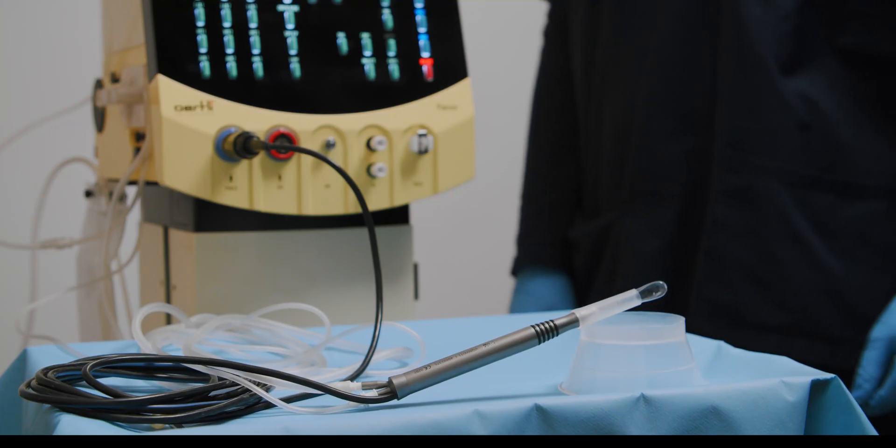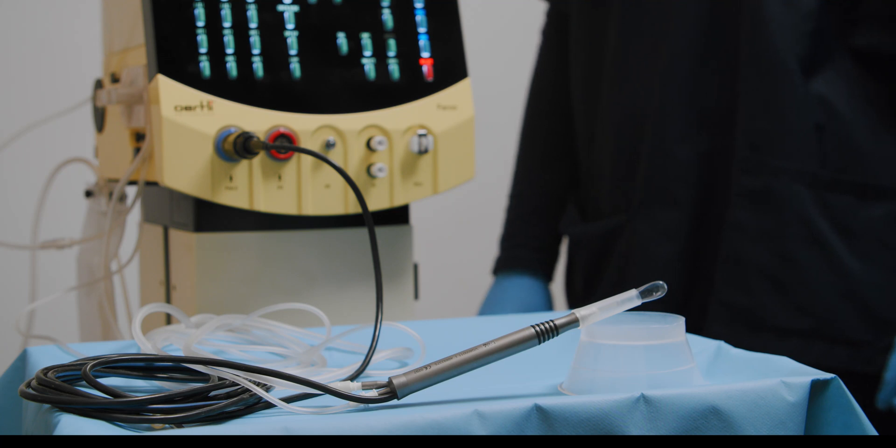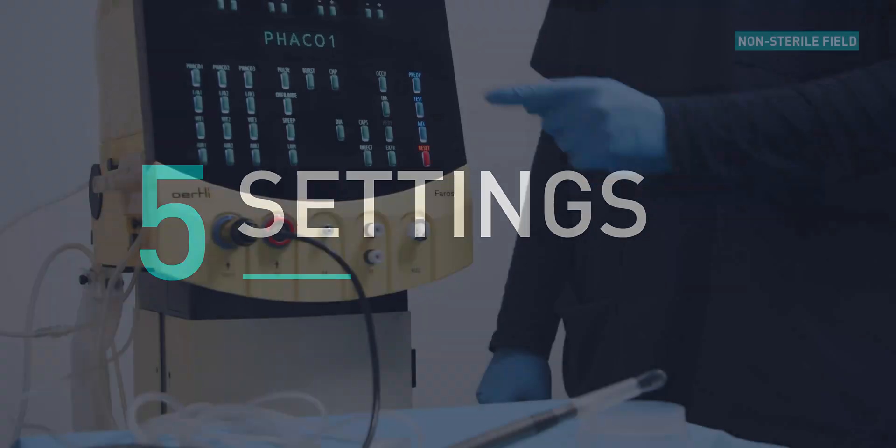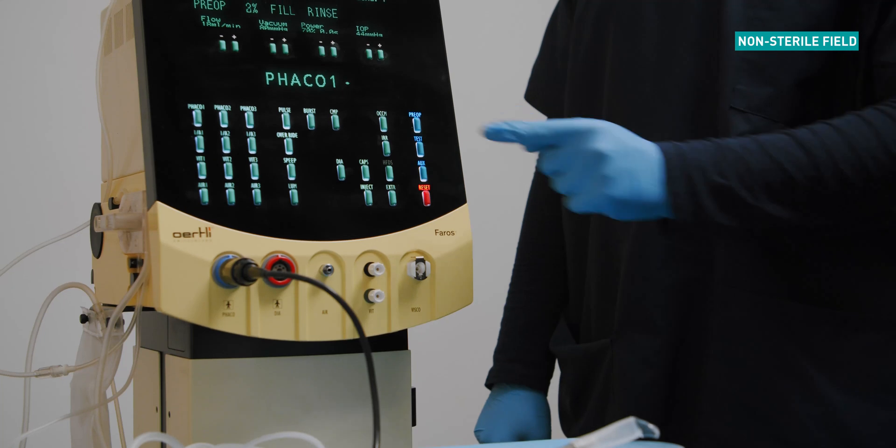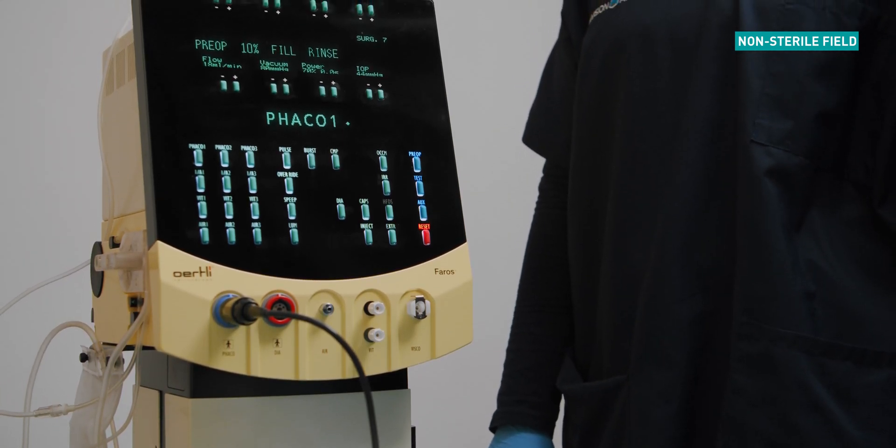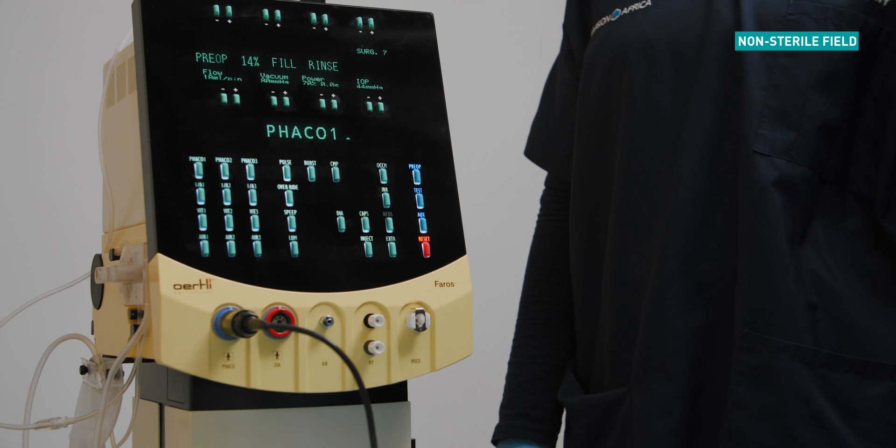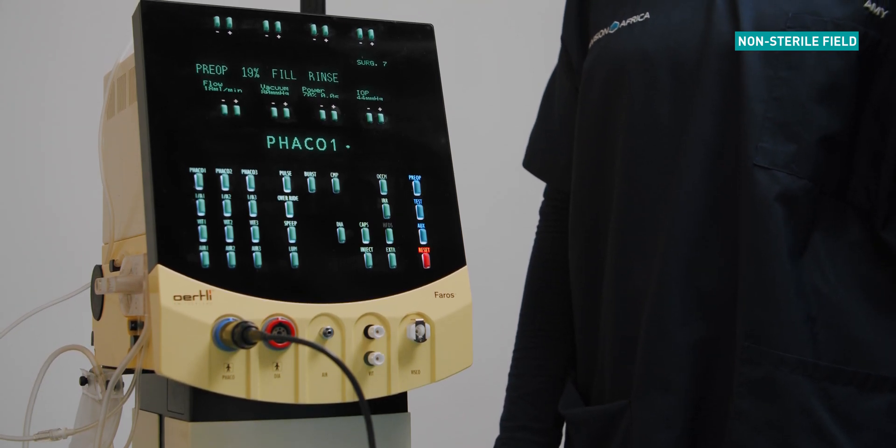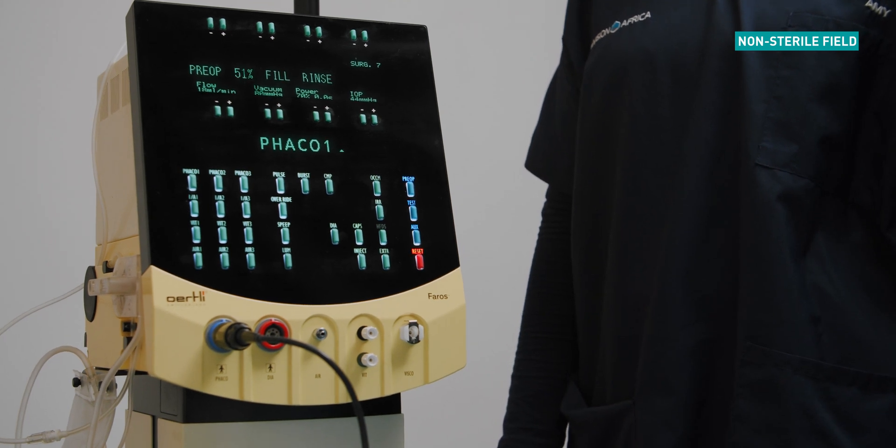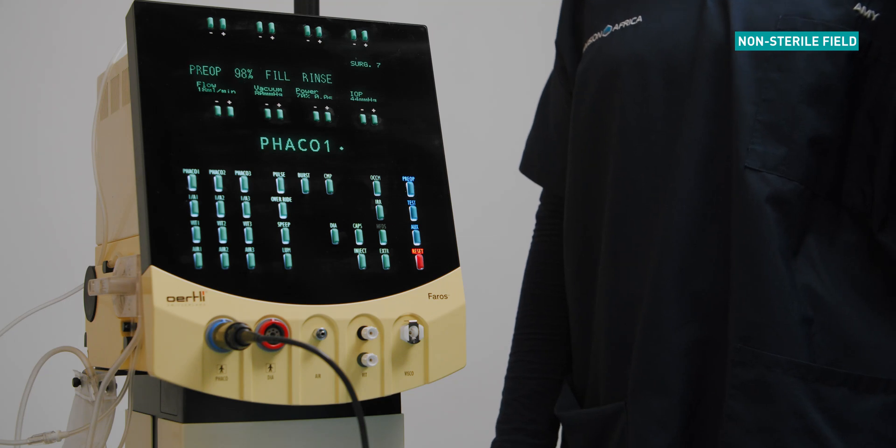To ensure optimal priming, place the handpiece at a 45 degree angle. Press the pre-op button to start the priming cycle. Allow the pre-op cycle to complete fully, approximately one minute. The phaco test will start automatically after a complete pre-op cycle. Allow the machine to run through the cycle up to 100%. The device is now ready to use.